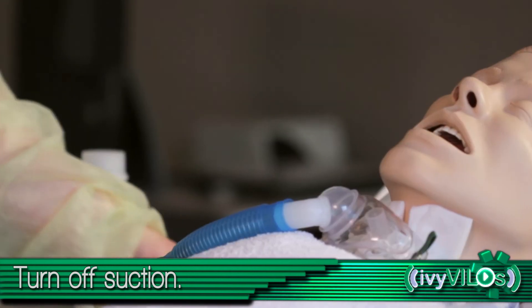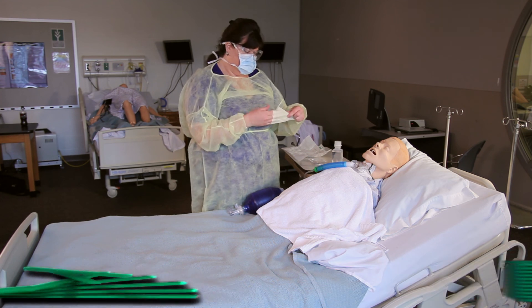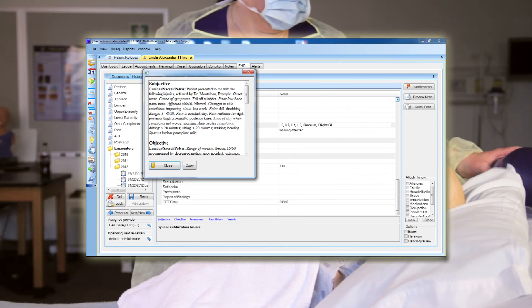Turn off suction. Assist patient to a position of comfort. Remove gloves. Put equipment back appropriately. Document in patient's chart.